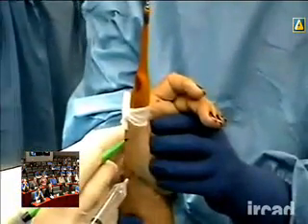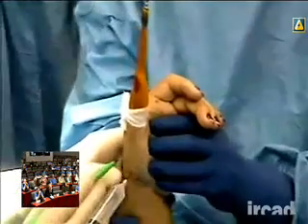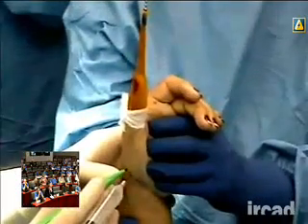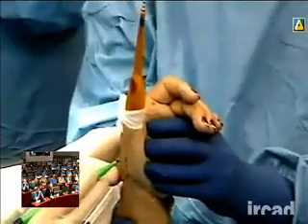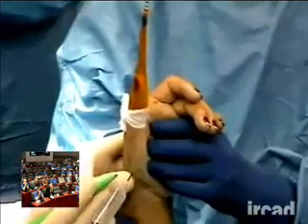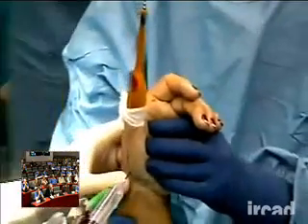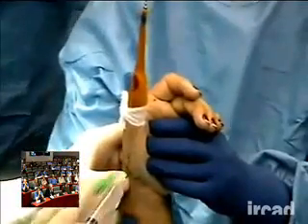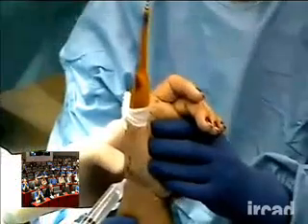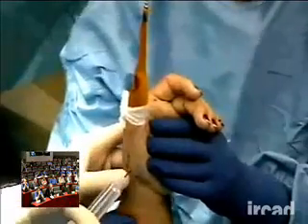The central axis to the metacarpal is here, and you can palpate with subluxation. You palpate the metacarpal, and I go on either side. I go palmar to the insertion of the APL. So here's our APL inserting here. And then the second portal I do with transillumination, which you'll see in a moment.